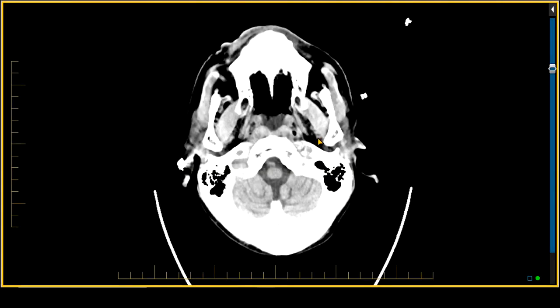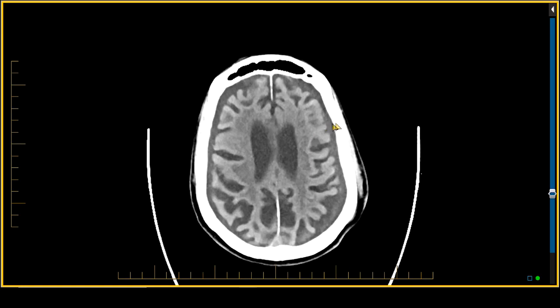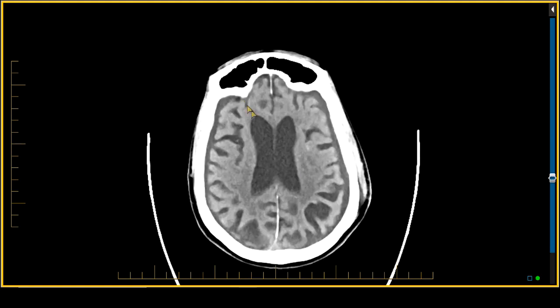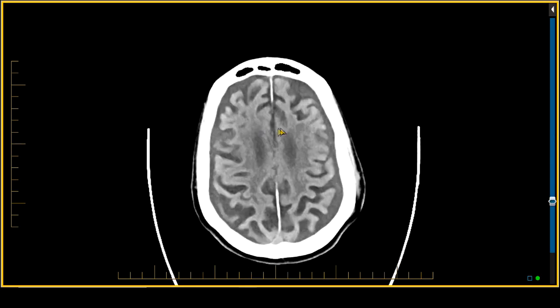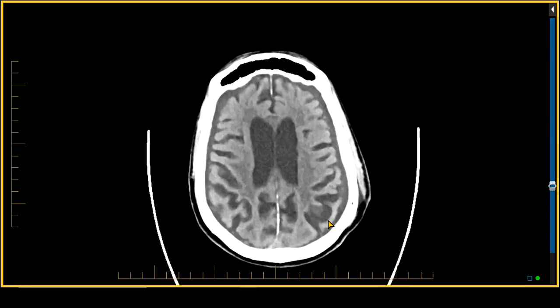This was a 62-year-old alcoholic individual who deteriorated while being evaluated in the emergency room. This is the initial CT scan from 12:30 in the afternoon. For a 62-year-old person, this is a lot of volume loss. You see sulcal enlargement, ventricular enlargement. And in addition, you see that the patient has low-density collections bilaterally — so-called chronic subdural hematomas.